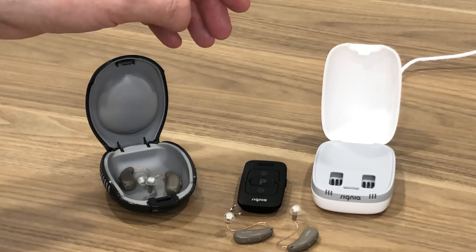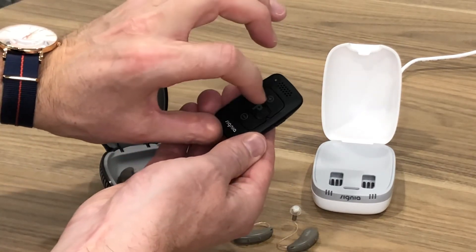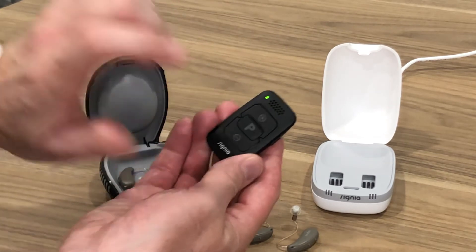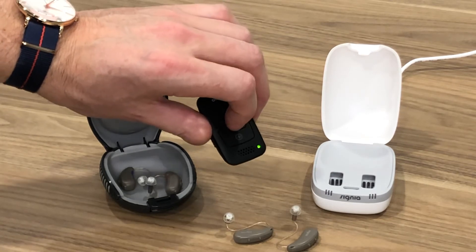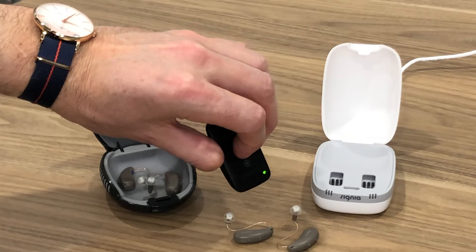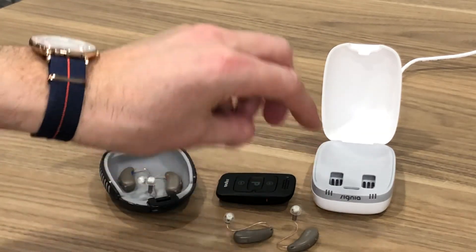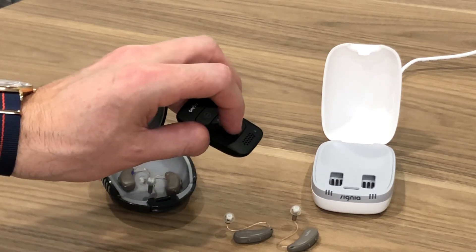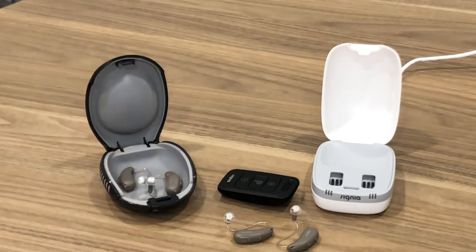Same process as before: hold down the program button with the remote in the off position, then turn the remote on — keep it pinned down — a few seconds, let go of the P button. Bring the remote close to the hearing aids and pin down the P button for about five seconds — one, two, three, four, five — let go, then shut the remote off. To double check, put the hearing aids in your ears, turn the remote on, and start hitting some of the buttons like volume up or down. You'll hear the hearing aids adjusting in your ear with little clicks and beeps, confirming you've paired the remote.